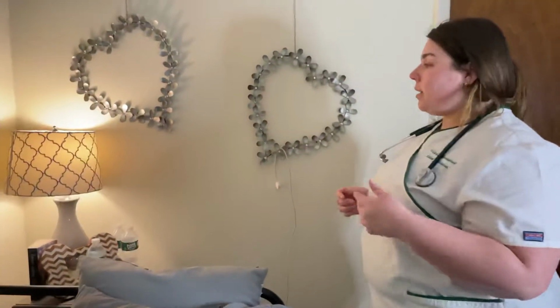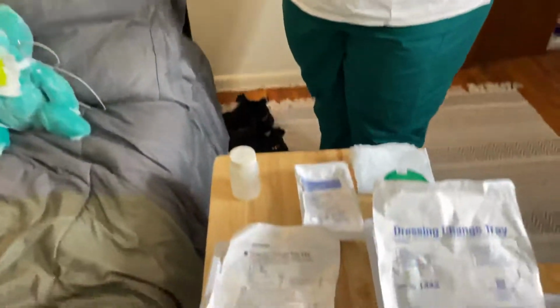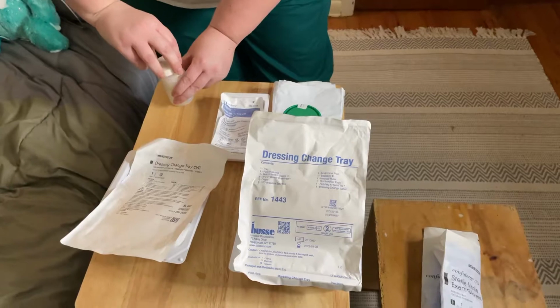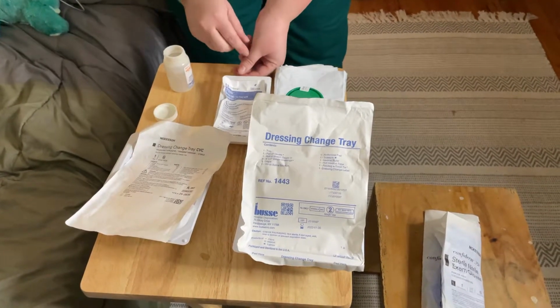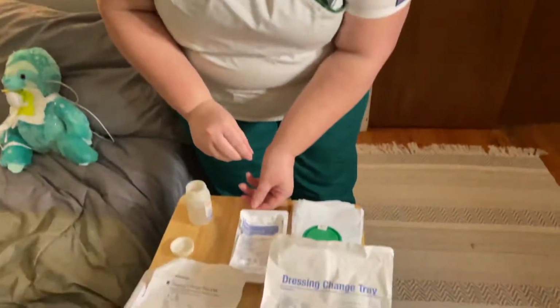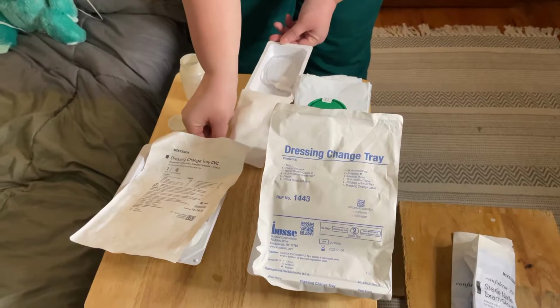While I'm pre-oxygenating the patient, I'm going to open my sterile field. So some of the stuff that I have is I have saline, which I'm going to open. I'm going to open my packages away from me to maintain sterility. So I have the suction catheter here. I'm going to open up away.